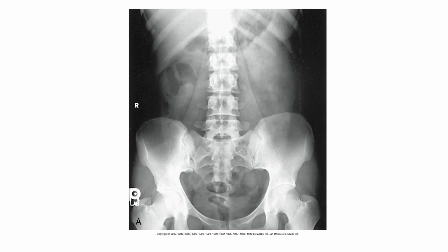Okay, so from that big giant air bubble, go across the spine past the other psoas muscle. You are now at the bottom of the left kidney. Okay, and so the left kidney, track it back up. You see there's two lines tracking back up toward T12 L1. The inside line is the left psoas muscle. That outside line is the border of the left kidney. Okay, and so you can see a rough bean shape.